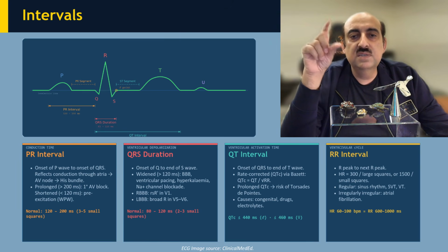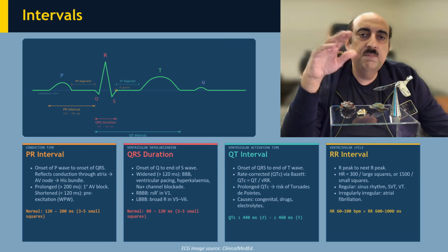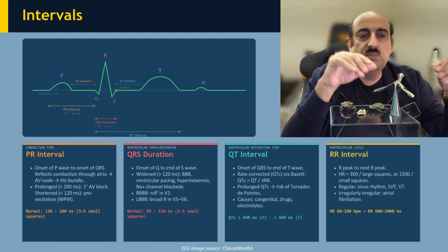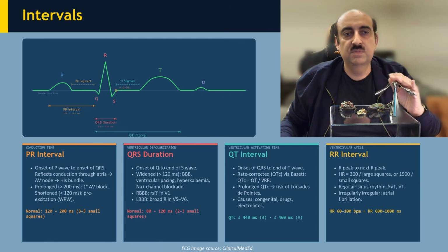The RR interval is the time interval between 2 consecutive R waves, and that is important for the ventricular cycle. You can also calculate the PP interval, which is the atrial cycle. So if there is a dyssynchrony between the PP intervals and RR intervals, that means there is an AV nodal block, and hence there is dyssynchrony between the atria and ventricles.